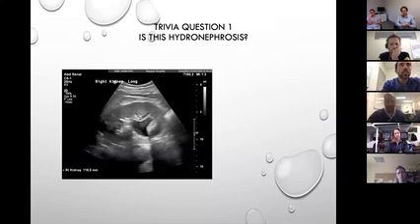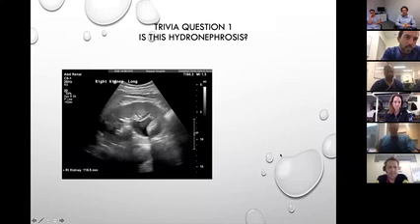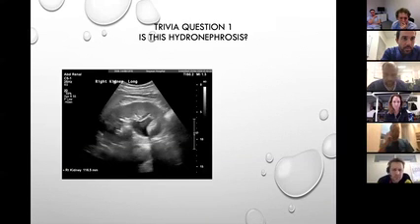All right, trivia question 1. Is this hydronephrosis? If it is, what grade would you say? Before you commit to that as hydronephrosis, what else do you want to do just to confirm that's not one of those mimics?